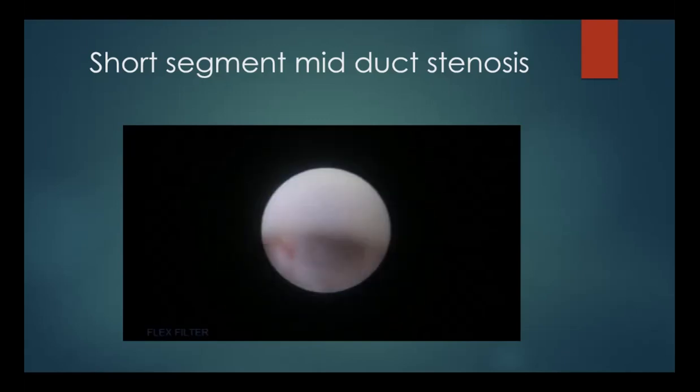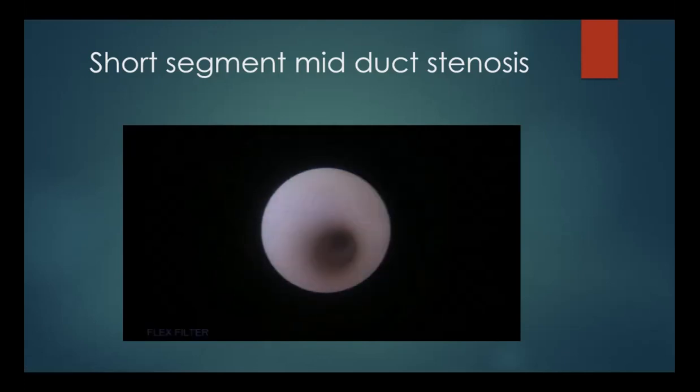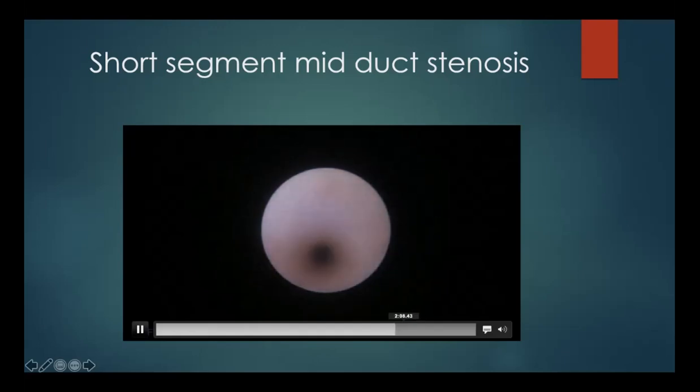I prefer to leave the stents for quite a long period of time, and I might have to change them in the interim period. But I feel more secure in the knowledge that prolonged stenting is going to translate directly into a prolonged treatment resolution. You can see on the top half of your screen that much of the mucosa has been scraped without causing a perforation. There's a ground glass appearance of your duct right there from the trauma of your dilatation. But if you stent it for 6 weeks, it heals quite nicely without a scar.